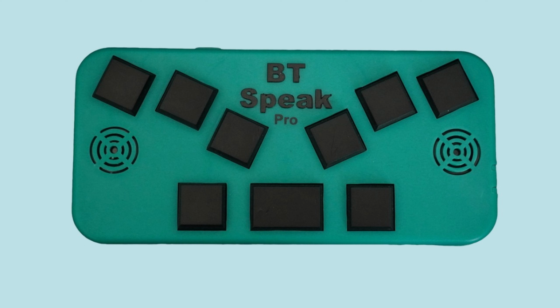For those who do not have a BT Speak, and of course, none of you yet have a BT Braille, the welcome screen is kind of an intro screen. It's not a manual, but it just welcomes you to the product, and it has links to other help files. So I'm in this welcome screen, but there are two files that I have open that are of interest to me tonight for the purposes of this demo. One of them is a file that I created called report, which I'm going to use to write my book report. The other file that I have is the actual book called Eden Rebellion.